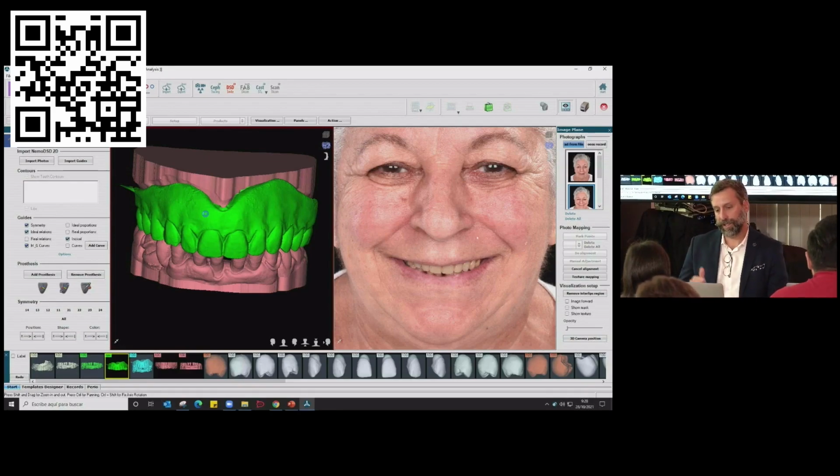So, which is marking the denture with some opaque material. We recommend gutta percha, which is super simple, cheap, and make some marks on the buccal, on the palate. We're gonna show this later on also, Chris. And scan the patient with the denture on, relined. Another important thing about relining is that we guarantee that the denture doesn't move during pictures and the CT, because if the denture moves, then we lose the reference. We will be linking things that are not correct. Okay, so very important for that reason also.